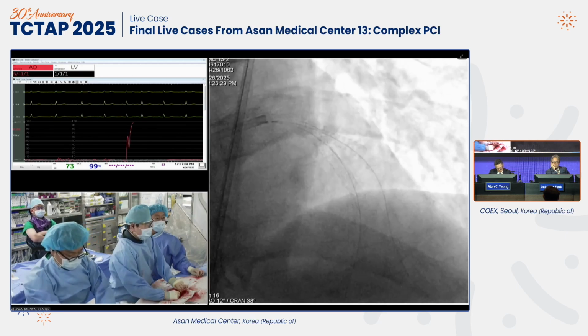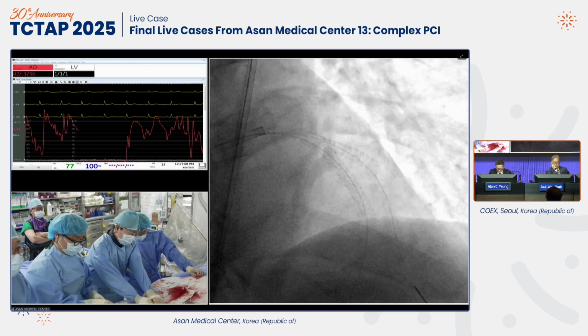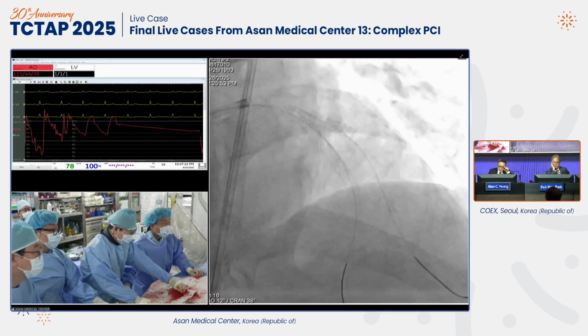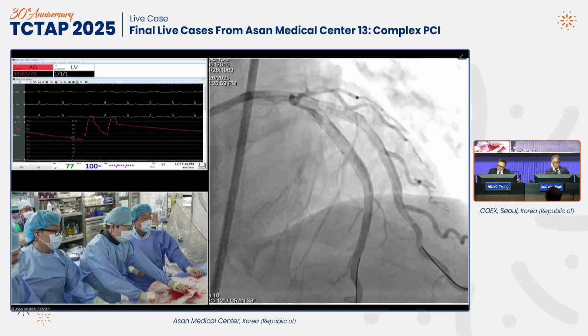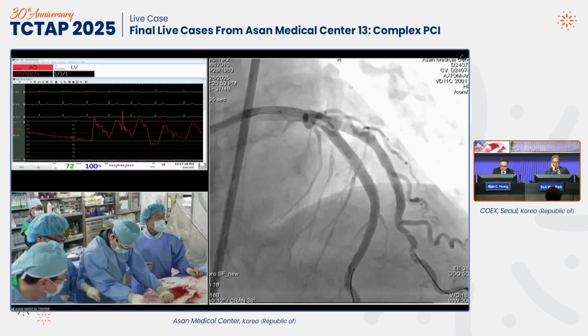However, all right, take a picture. Okay, ready? Ready? I like it, right. Would you show the spider view? Spider view, yeah, Spider, please.